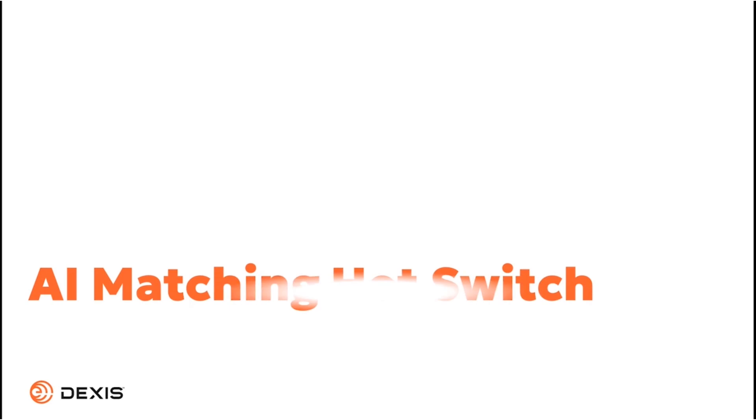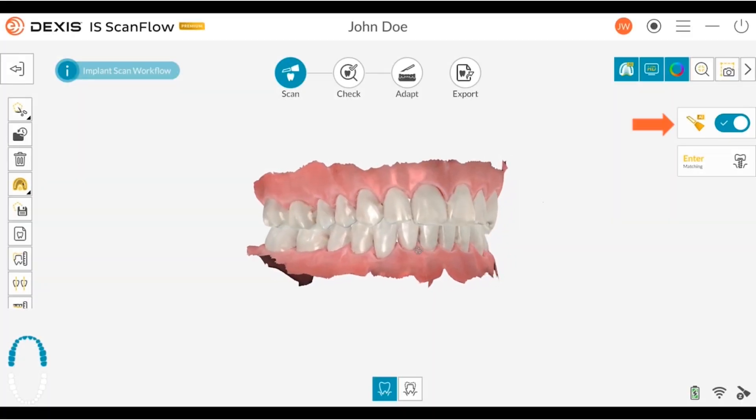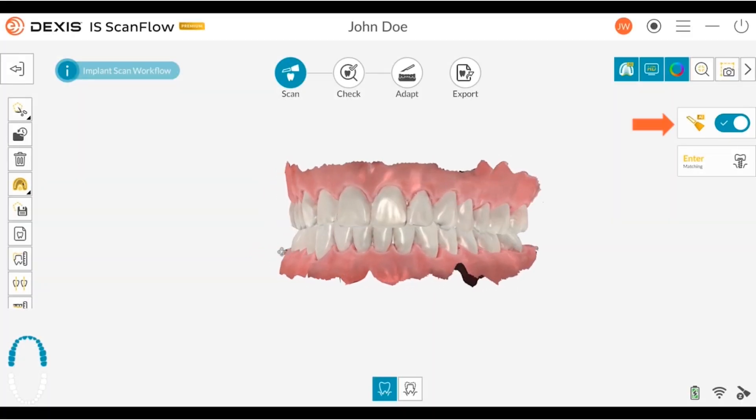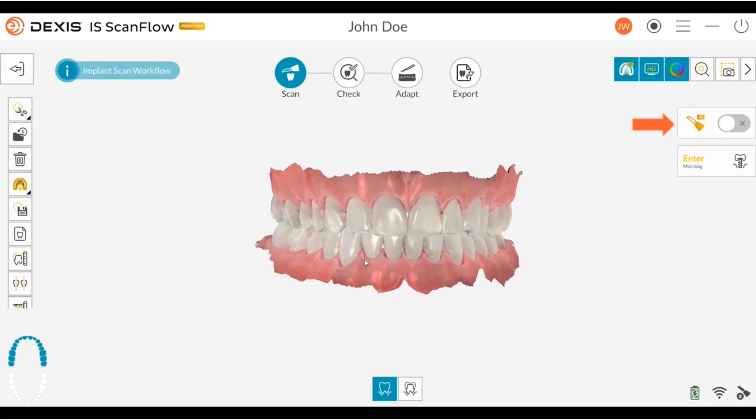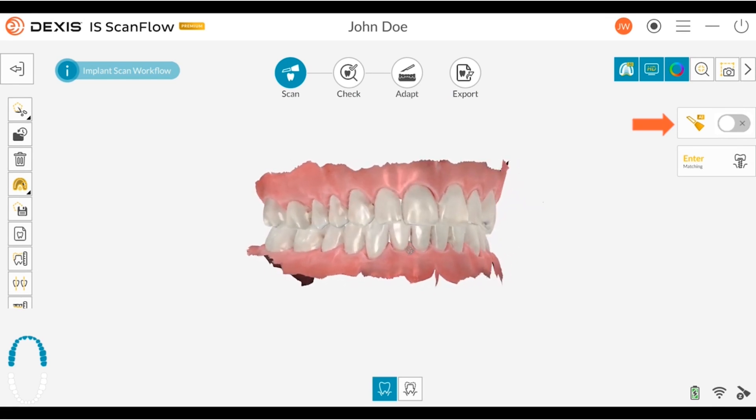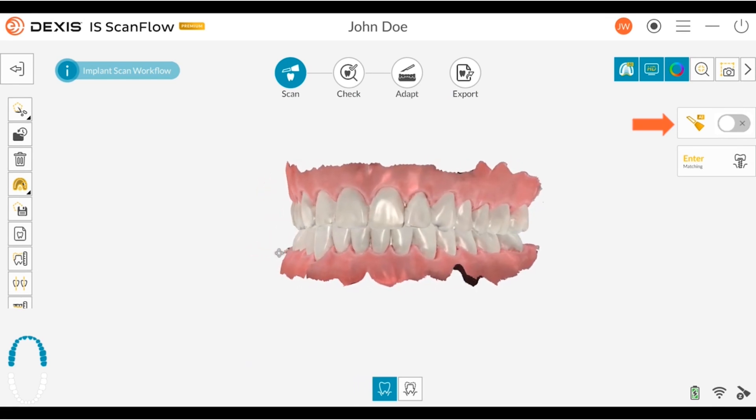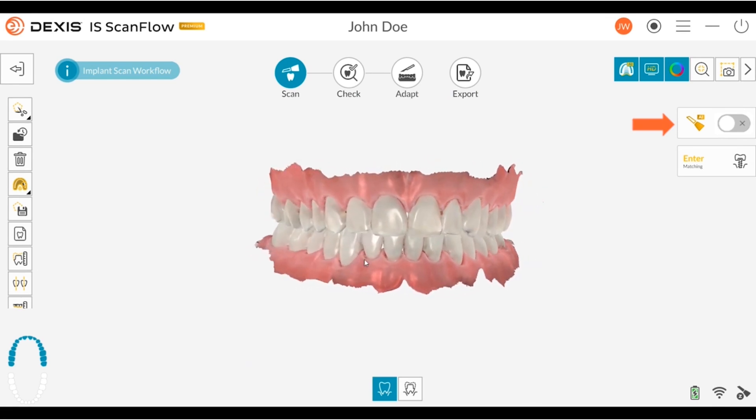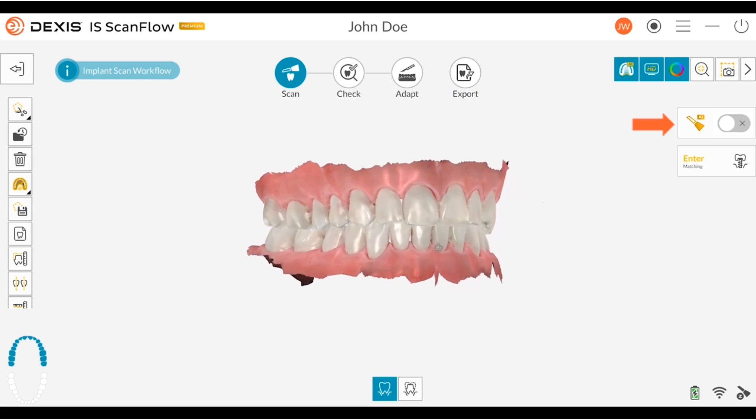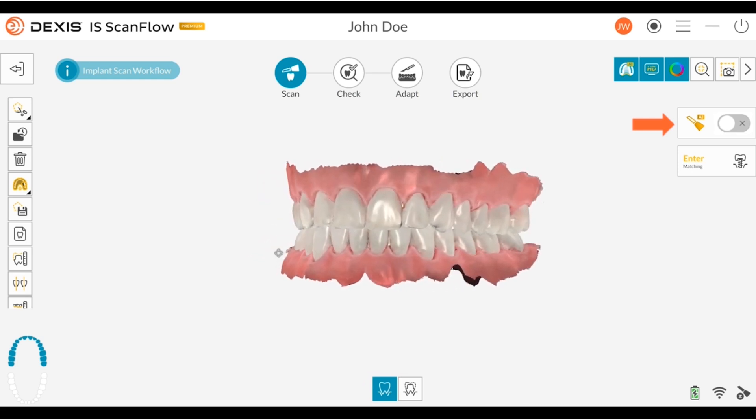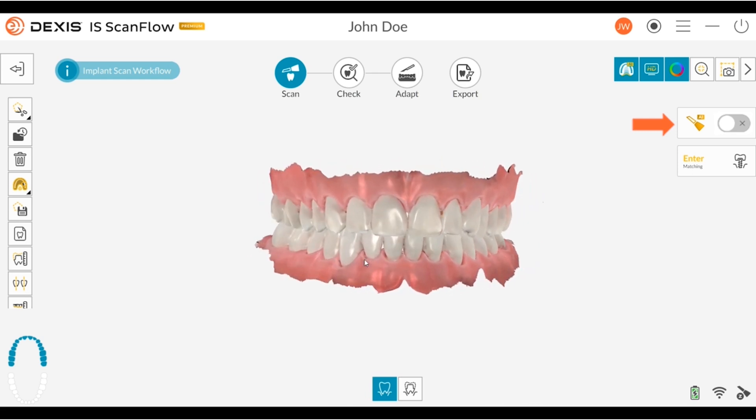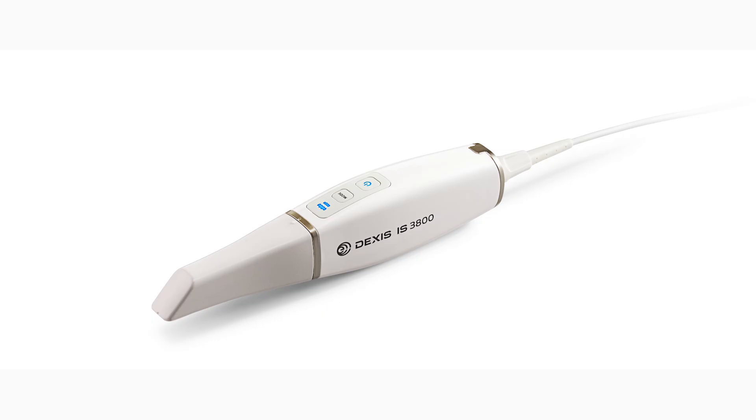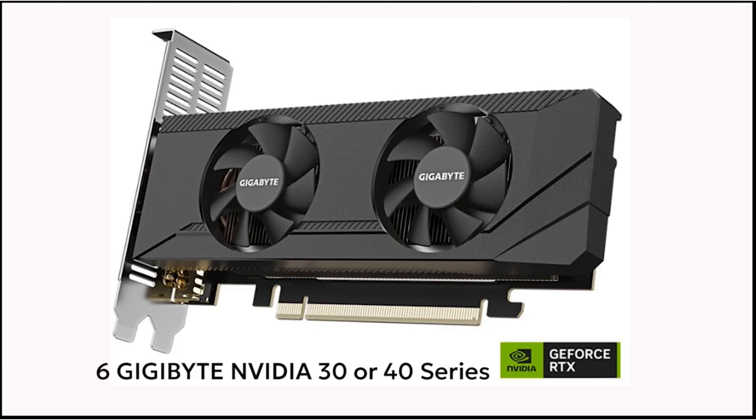AI Matching Hot Switch. The new version offers the convenience of switching AI matching on and off anytime during the scanning, which allows you to choose the scan mode best suited to your needs. Note, AI Matching will only work with our Dexis IS3800 and Dexis IS3800W intraoral scanners, and on PCs with a 6GB NVIDIA 30 or 40 series graphics card.